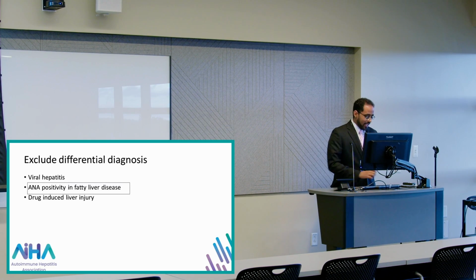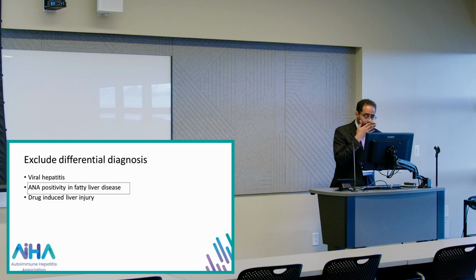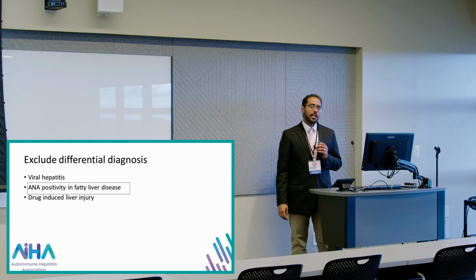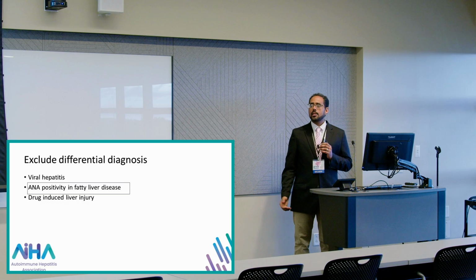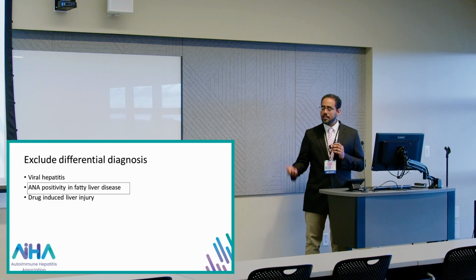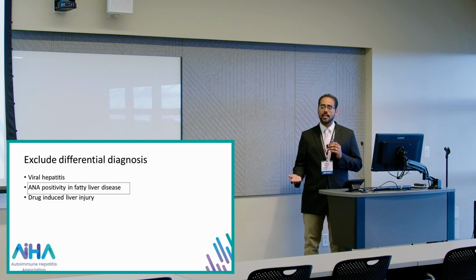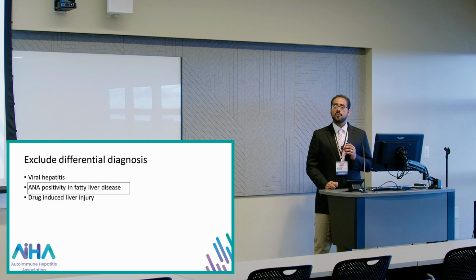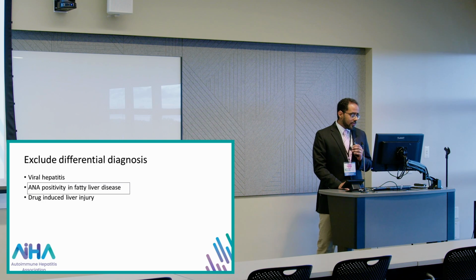Okay. Something else that we do is help identify variants. Sometimes, autoimmune hepatitis will not have an ANA positivity that helps them clinically in the lab, but we still look under the microscope and we swear that this looks exactly like a classic case of autoimmune hepatitis. So we help the clinician identify variants like an ANA negative autoimmune hepatitis. I'm not going to talk about the overlap syndromes because I know you are going to have talks about that.